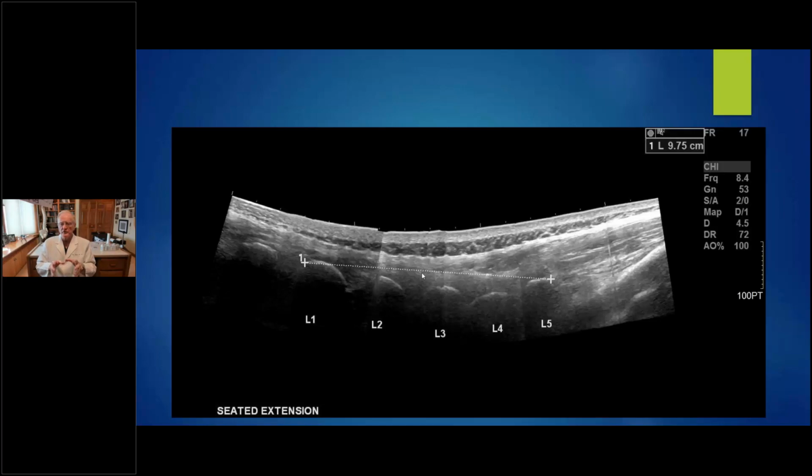To determine what are the complete biomechanical changes within the spine when we apply distraction manipulation, and what will be the clinical outcomes with various forces of application to lumbar segments. Let's move to the instrument and study together.